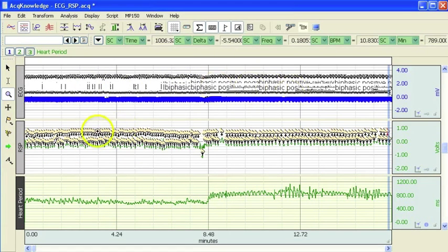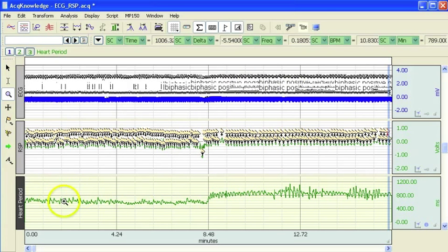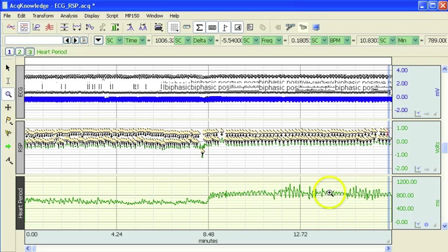So this is the ECG channel, the respiration channel, and here is my R2R interval.